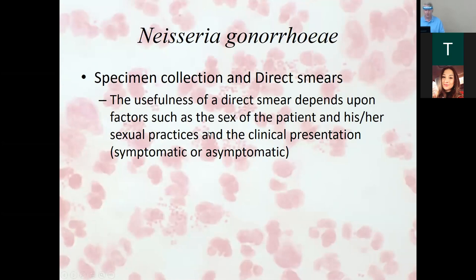Neisseria gonorrhea, we can do different things. We can do a direct smear. Sex of the patient, sexual practices, clinical presentation. You know, we're not taking this history. We're not figuring out if this person really needs a GC, or a gonorrhea. This is just given to us and says, hey, we need to check this patient for Neisseria gonorrhea.